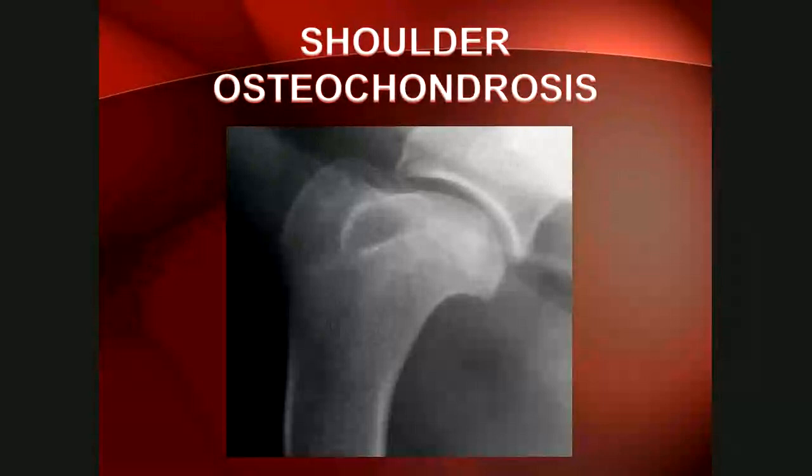Here are examples of shoulder osteochondrosis. The caudal third of the humeral head should have a smooth outline — in one case it is flattened. In another example, there's a very large radiolucent area over the caudal humeral head with two slivers of mineralized material overlying it, consistent with a flap of cartilage that has broken off and mineralized — this would be OCD. On the right-hand image, there's only a saucer-shaped defect in the subchondral bone without an overlying flap, consistent with osteochondrosis.